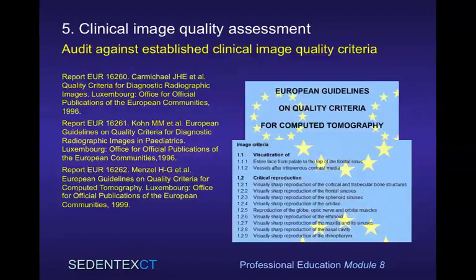Here are some example image quality criteria for examination of the paranasal sinuses. Unfortunately, there are no comparable established criteria for dental cone beam CT at the present time.